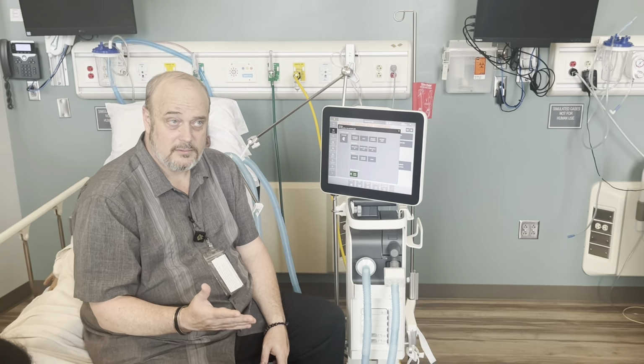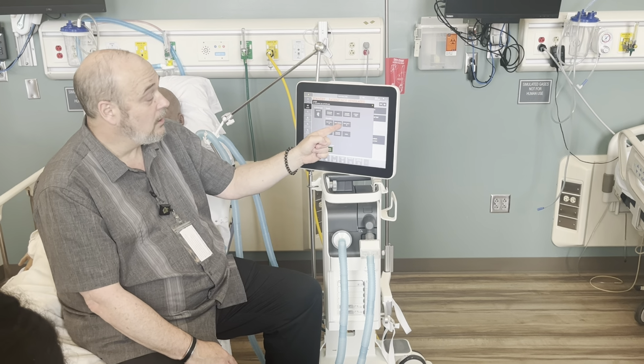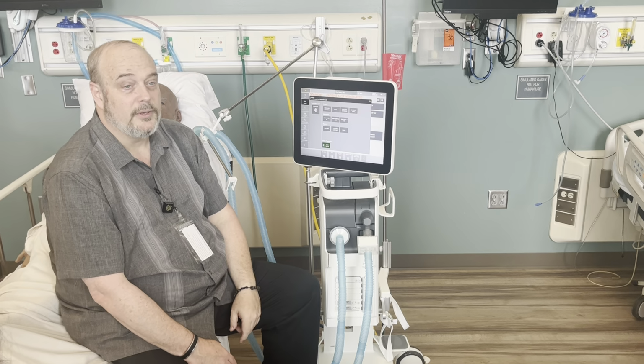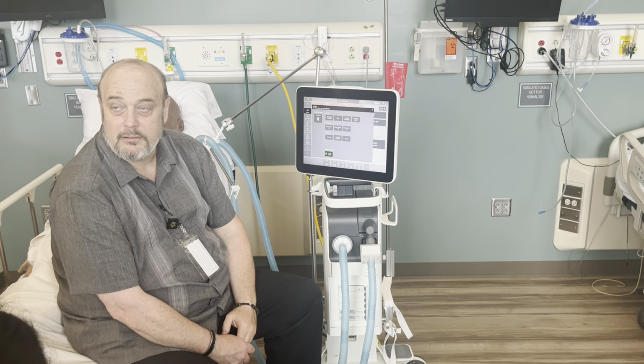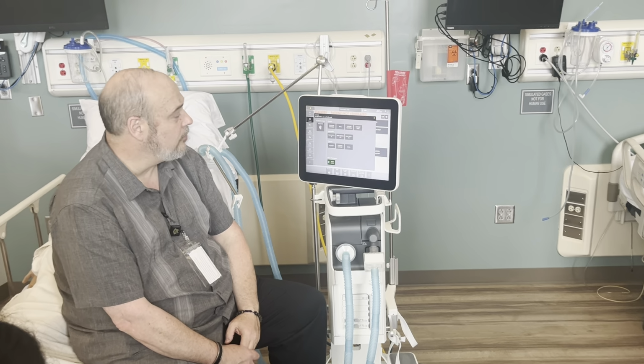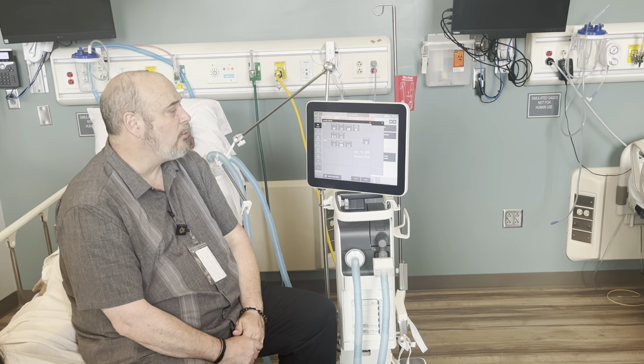We'll worry about this in the fall. And then the difference between these. So this is 3 modes. Now we're gonna make those modes with pressure support ventilation. And then these down here are a little bit different. Don't worry about NAVA. We don't even do that in the adult world. That's just purely in the NICU. I think it's a great idea and it works great, but it costs a lot of money, and you'll find that money goes to babies, not adults. And then CPAP pressure support. So this is an interesting thing here, volume support, which we're not gonna go over much today.